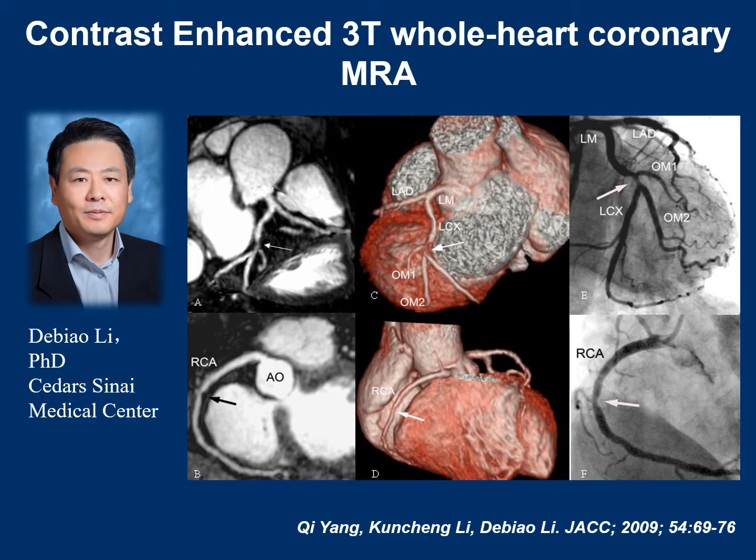Led by Professor Debiao Li from Cedars-Sinai Medical Center, they performed another clinical trial using the contrast-enhanced 3T whole-heart coronary MRA technique. This technique can provide very high-resolution clinical images of the coronary arteries, and this bifurcation stenosis can be clearly delineated compared with the invasive DSA.